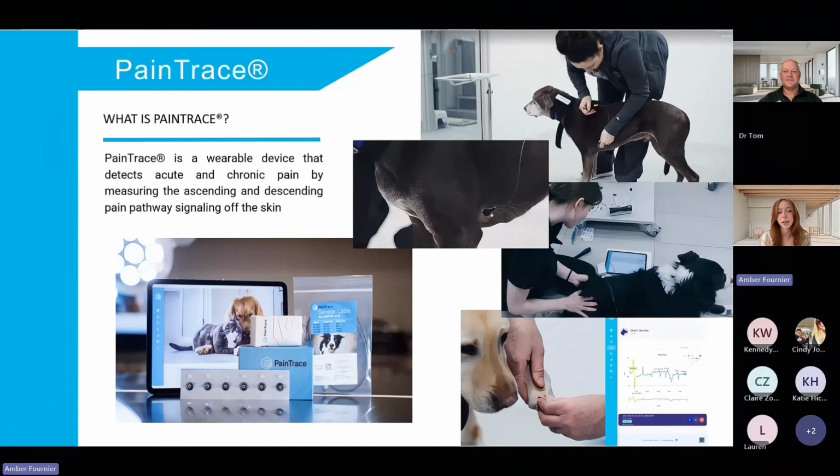So if they're placed here, it's picking up on the neurosignaling of the descending and ascending pain pathways. So it's picking up on pain anywhere in the body. So even if the sensors are there, you can be picking up on pain at the hips. And like Dr. Tom saw, he was able to pick up on pain when he extended the left shoulder. You're also able to pick up on any cervical pain, spine pain, anywhere in the body, you can pick up on pain. But this is where we get the best signal to pick up on that ascending and descending signaling. And that's why they are placed there.